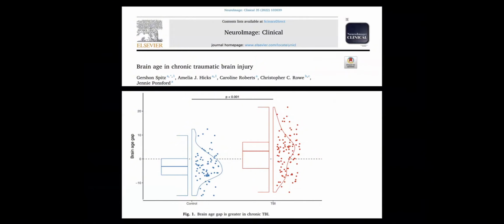Brain age refers to the ability to take a brain scan, measure the individual volumes on high resolution 3D T1 volumetric sequences, compare that to normative data, and ask and answer the question, does the actual age of the brain scan align with the chronological age of the individual based on how large we would expect brain areas to be for somebody of that chronological age?